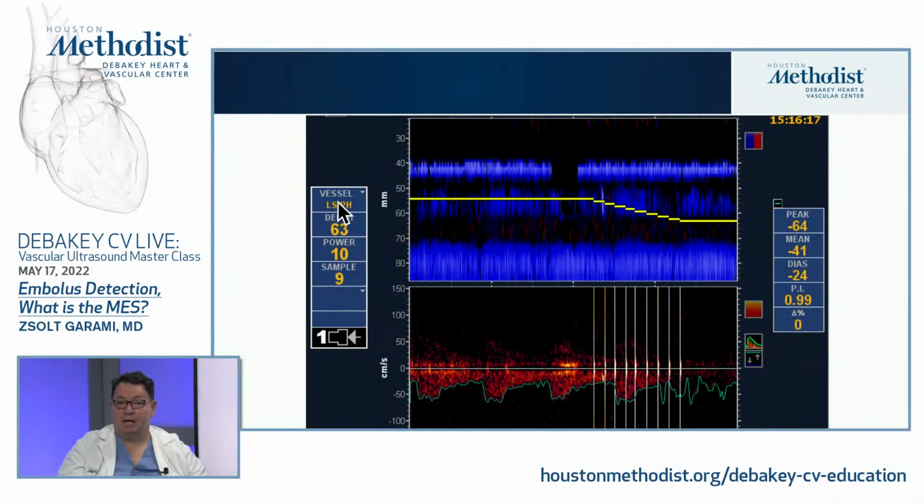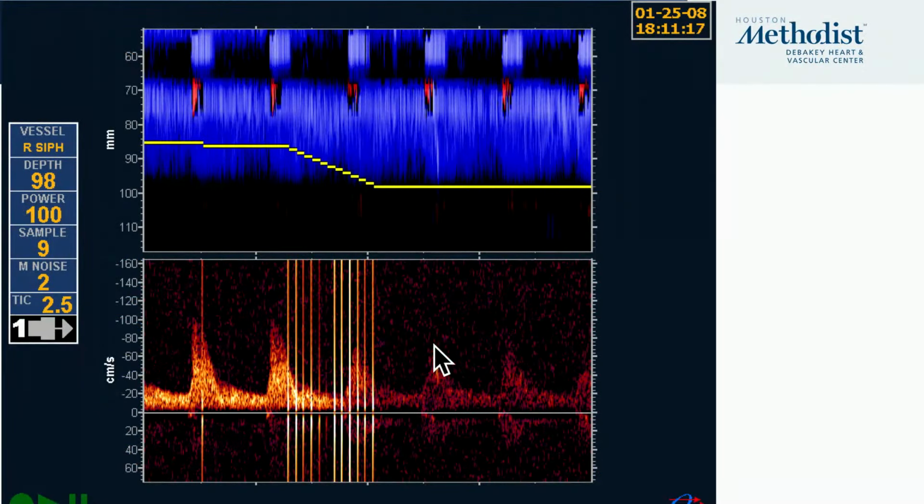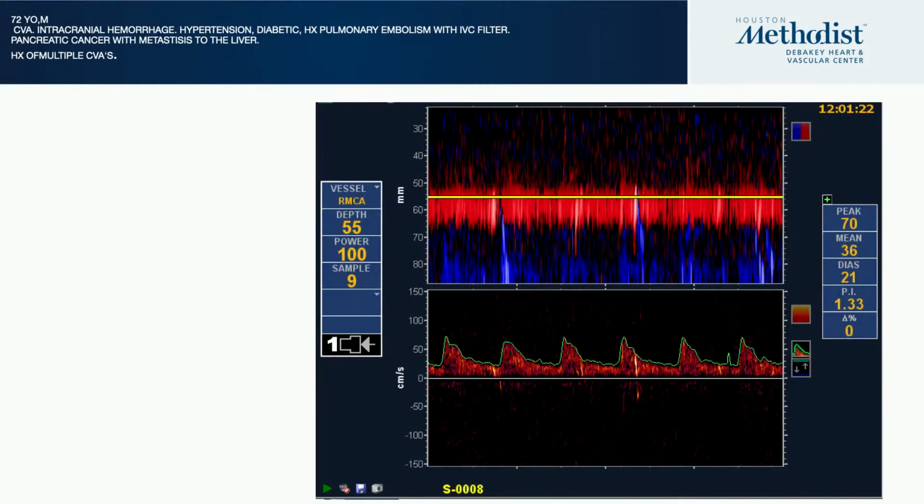And what it tells you, this is again a left siphon. This is a reverse ophthalmic artery feeding your carotid. So it's definitely interesting to know that with a total carotid occlusion, even with your collateral, you're still bringing up tiny clots, tiny microembolus signals, into the reverse ophthalmic to the ICA. So here's one, and unfortunately I didn't pick it up, just barely, but on the M mode you will just go back and monitor that signal a little bit more.